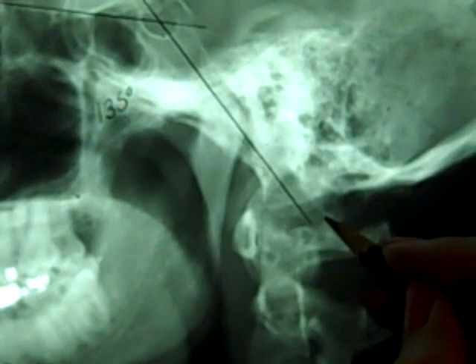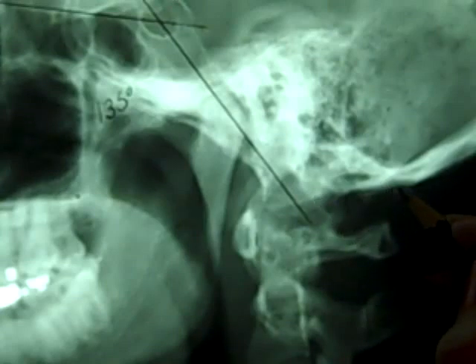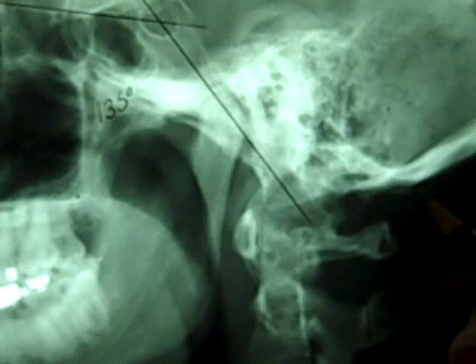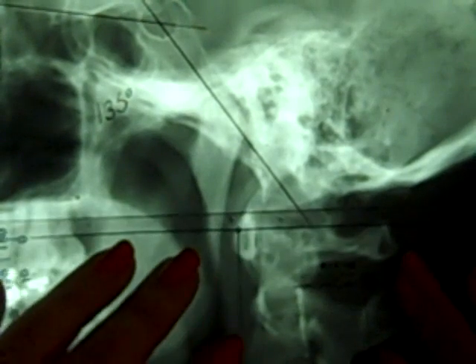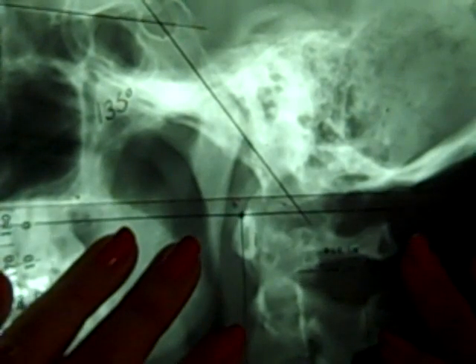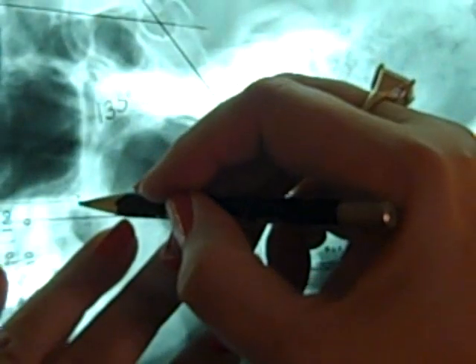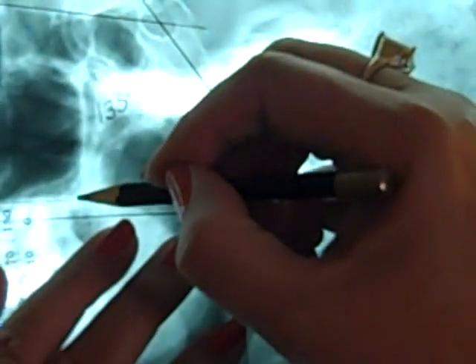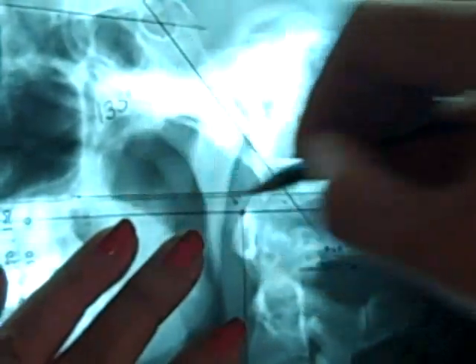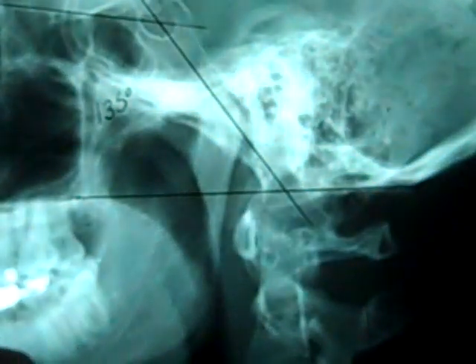We do have a mastoid process coming down right here, so don't take off on the mastoid. We are using the floor of the skull, or the base of the occiput, and the lowest point would be about right there. So I'll line my protractor up with those 2 points, and I will draw a line across right there.